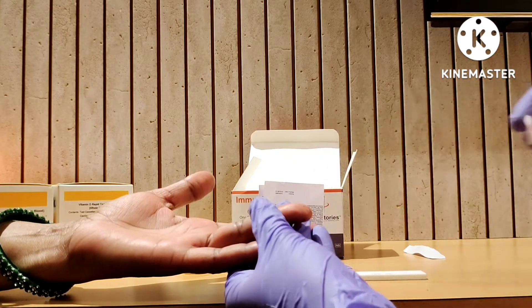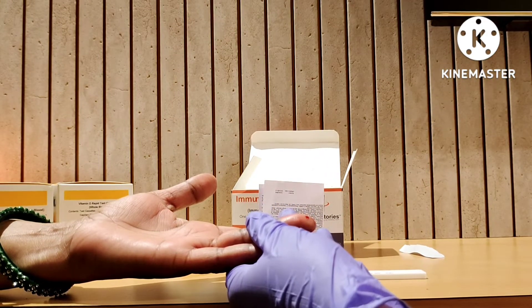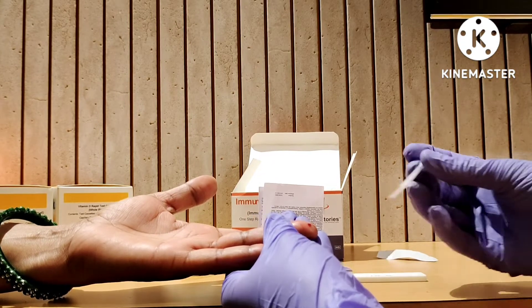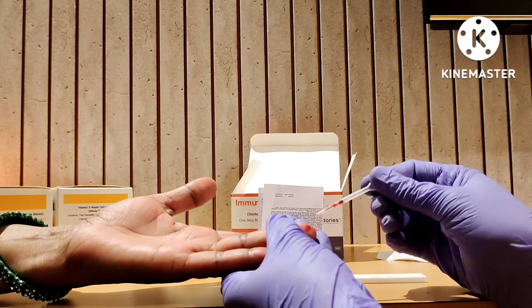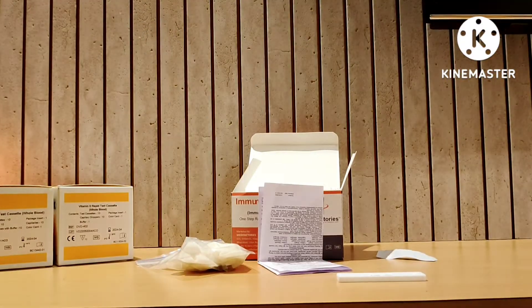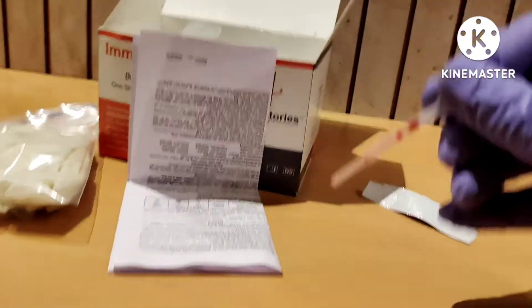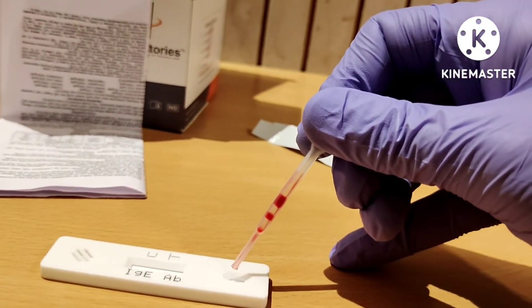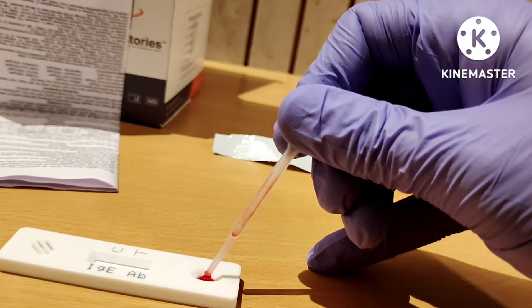We have to wipe away the first drop of blood, and then with the help of the dropper we can collect a drop of blood. We then drop this blood into the sample hole.